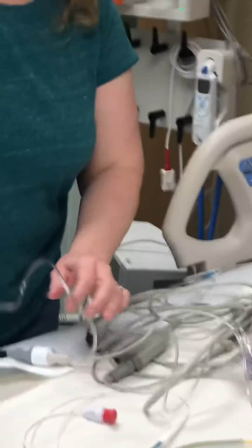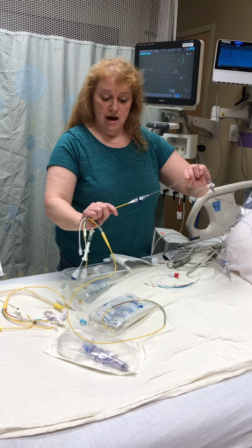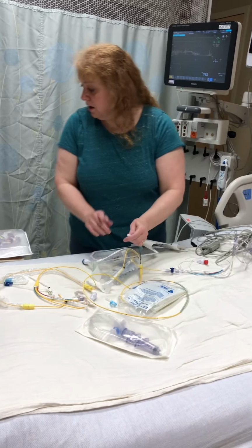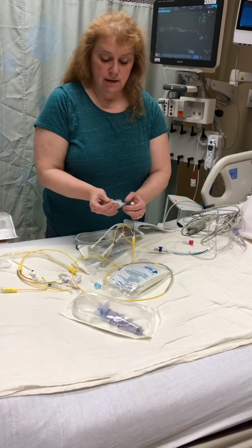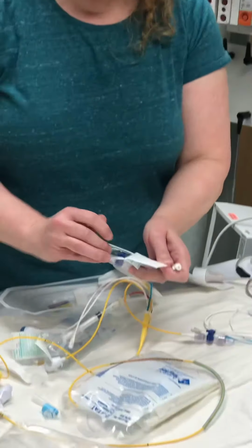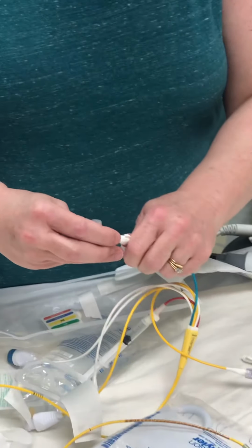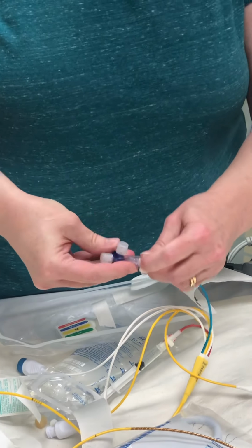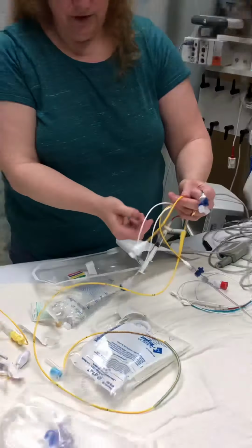If they come back from cath lab with the Swan in place already, and all you have is the pressure tubing, a lot of times they will come back with all your stopcocks attached like this and just maybe capped.